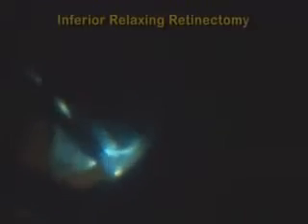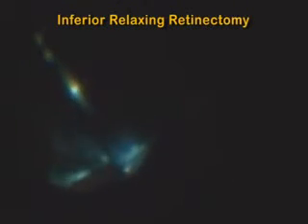In suspicion of a peripheral traction as a cause of subretinal air migration, 3 to 4 clock hours of inferior relaxing retinectomy is performed, but unavailing. More PFCl is injected and a 360-degree relaxing retinectomy is done.